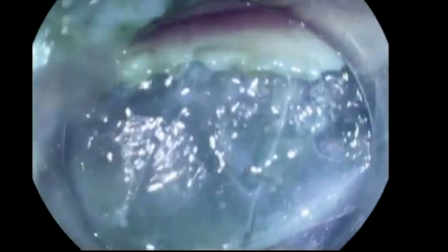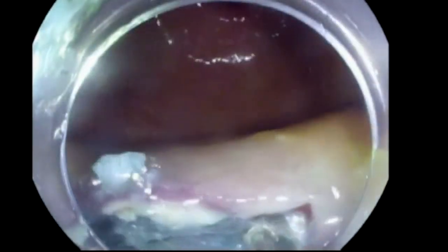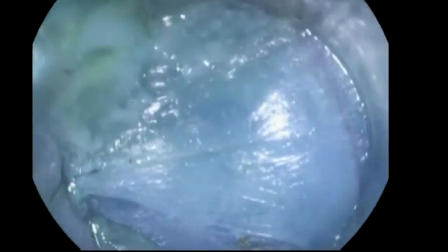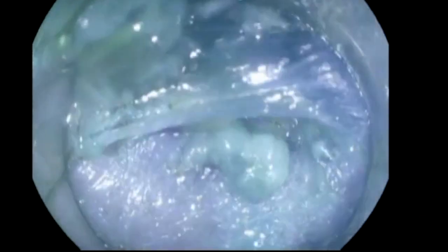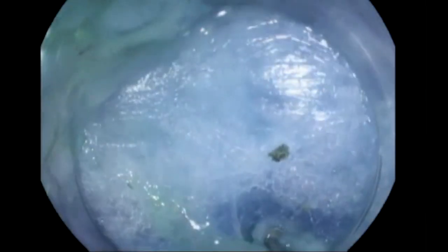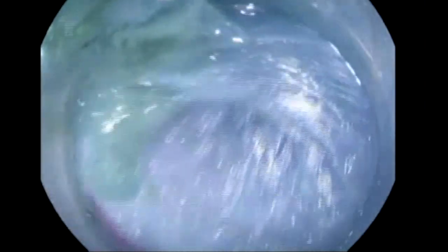As much as I can, I'm trying to inject the submucosa and work on dissecting the fibers of the submucosa on the edges, which will prevent my scope from going in. As you see here, I'm cutting on the right side, then the left side, then I push my scope through the cap inside. Once I'm inside, I will dissect some of the submucosal fibers to create a nice tunnel. Gradually the tunnel is opening — inject more, dissect more — and keep doing this process until you are able to advance the full scope within the tunnel without disrupting the mucosal surface.